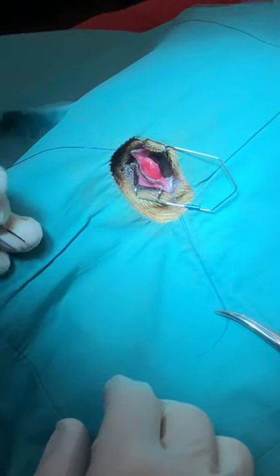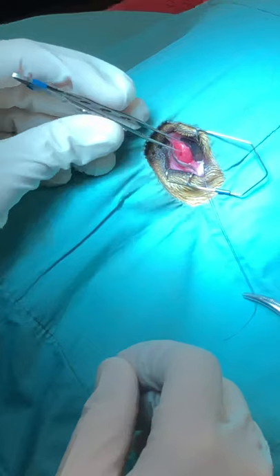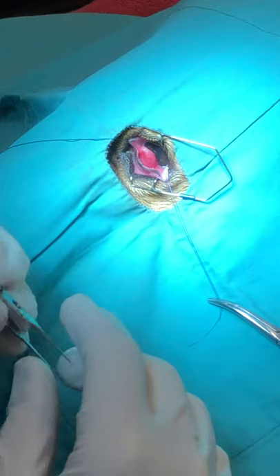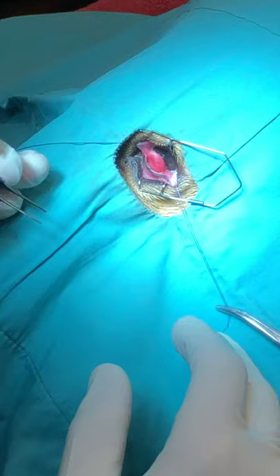We're going to be doing the modified Morgan pocket technique for the replacement of a prolapsed gland of the third eyelid. It's important to replace the gland rather than cut it out because the gland produces a significant number of tears — at least 30% in most dogs and in some dogs up to 70% of the tear production. So definitely don't want to cut this thing out.